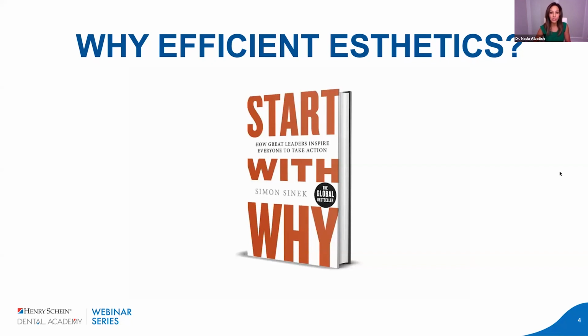And so why is efficient aesthetics important? Why would you consider a change from whatever you're doing in your practice to a new system? And this is the thing. As a general practitioner in a busy practice over the years, what I realized is it's a common occurrence. I'm sitting there, I've prepped my patient, I've achieved my moisture control, I've started to etch, and I'm ready to go on the most technique sensitive part of my direct restorative, which is placing my composite, right? Bonding and placing a composite.